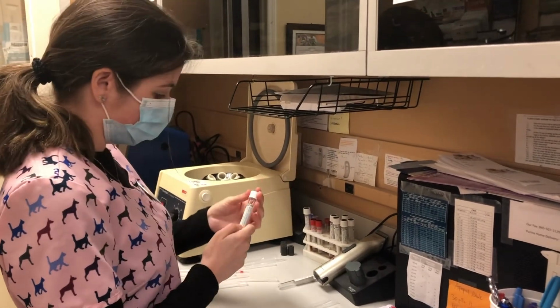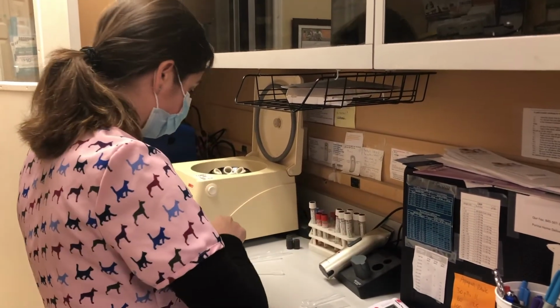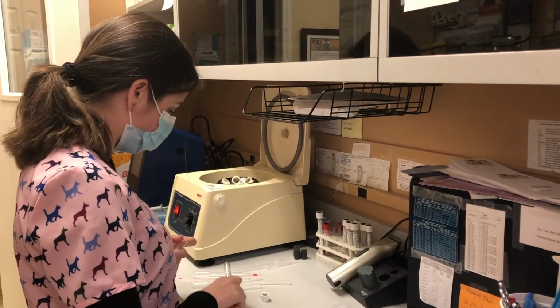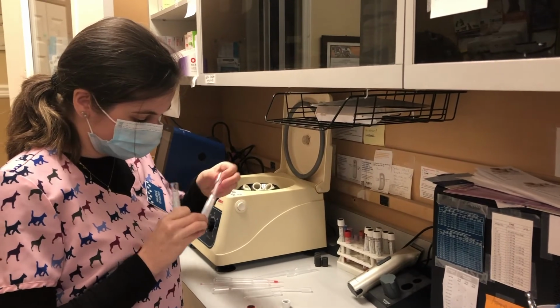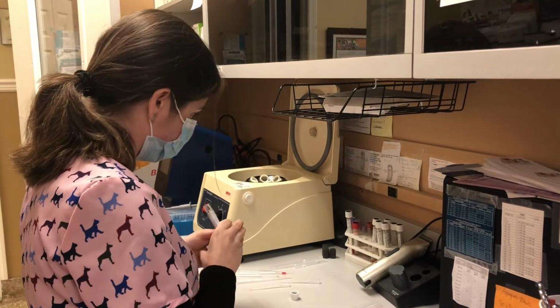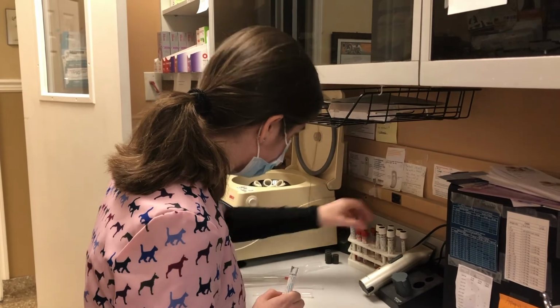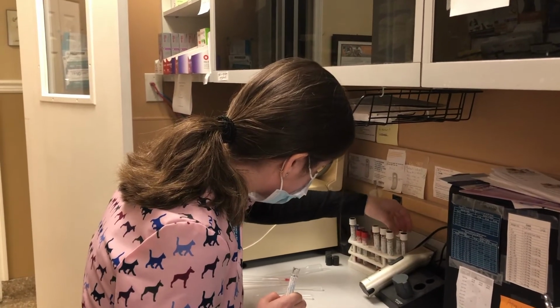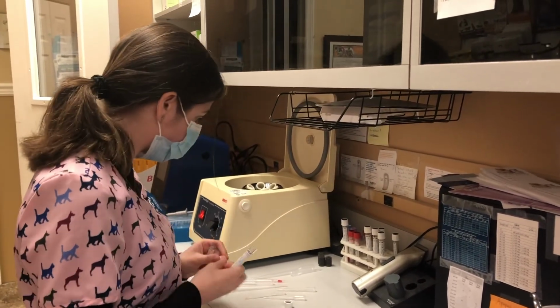So this is going to be my recipient control, and I'm going to do the same thing with my donor. Donor serum. And then my donor cell suspension.